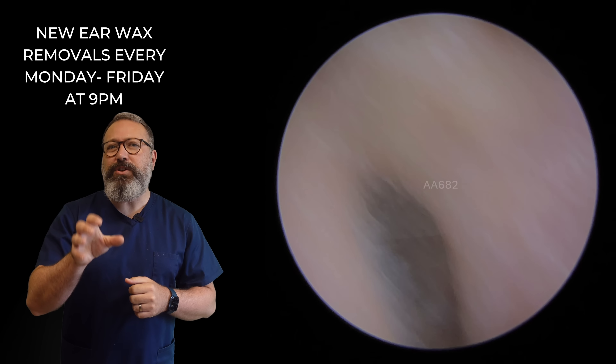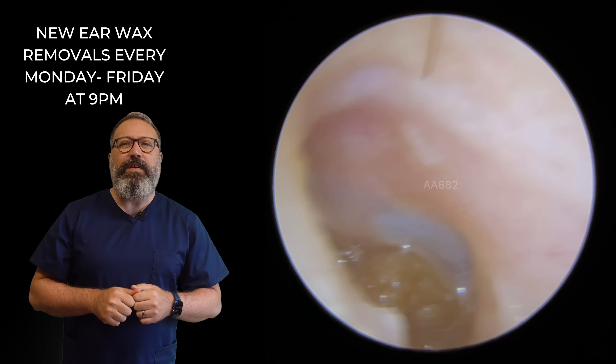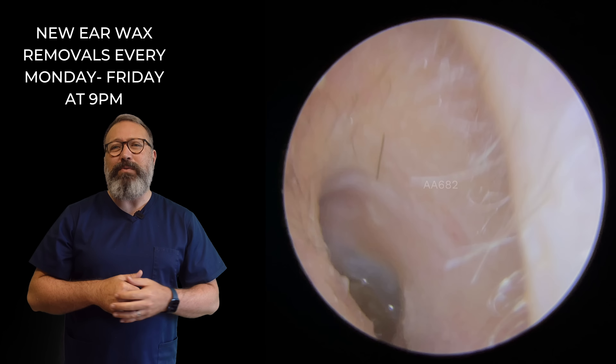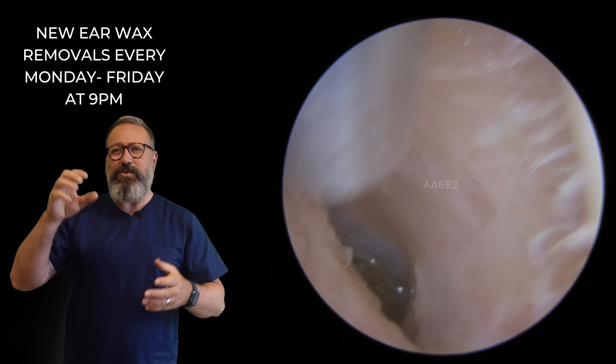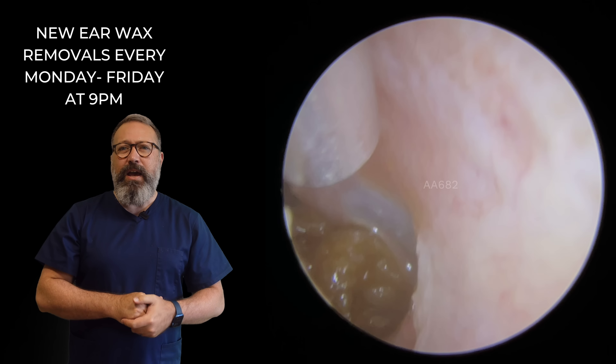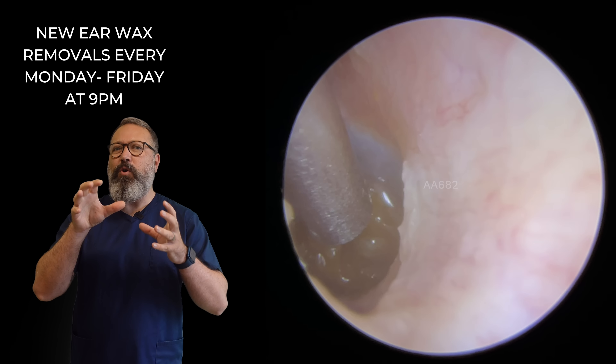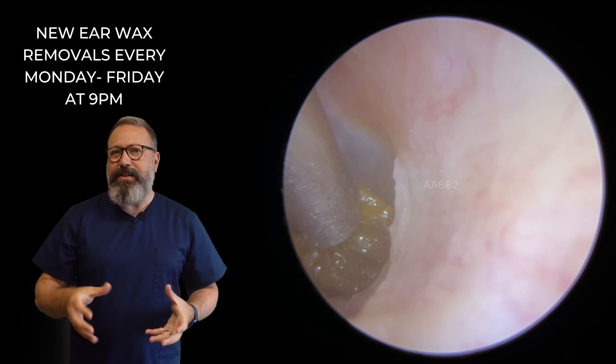So next patient in the compilation. Now this lovely lady came through feeling very blocked up — lots of tinnitus as well for this particular patient — and we can see we've got this really deep plug. Now this is right up against the eardrum here. I've got the standard size suction tube in here because the plug looks pretty big, so I'm hoping we can get a good grip on the whole plug and take this out.